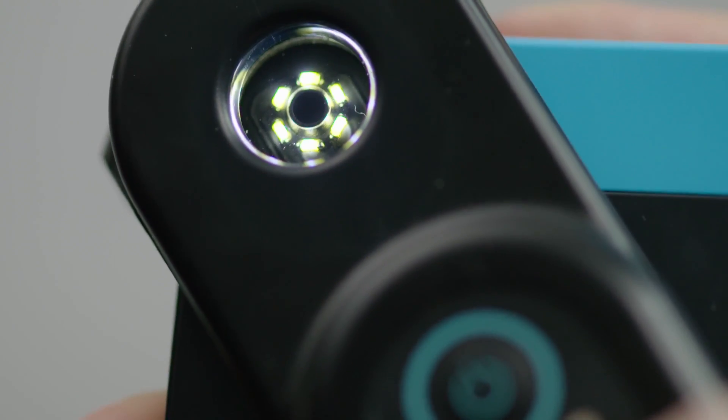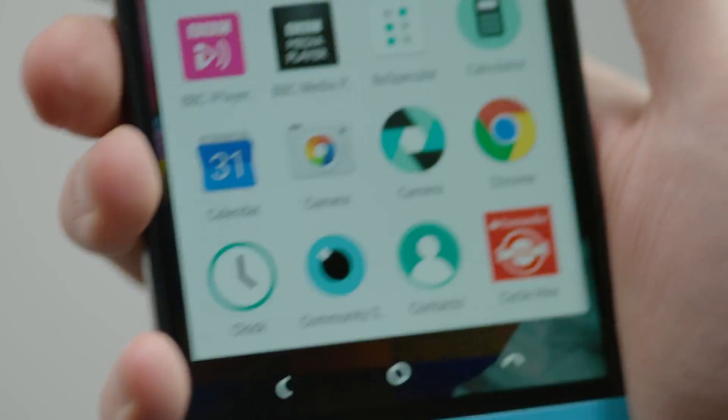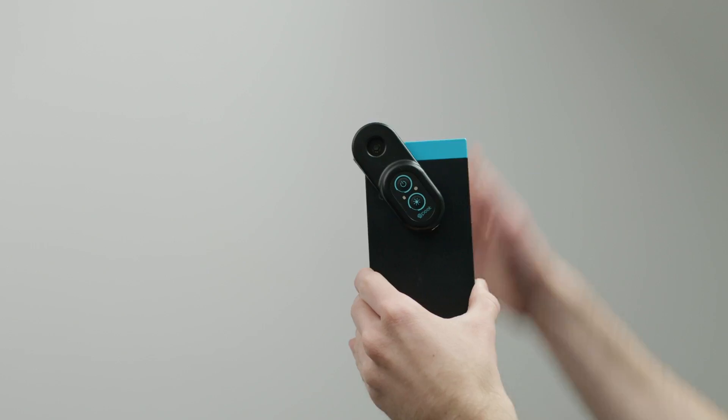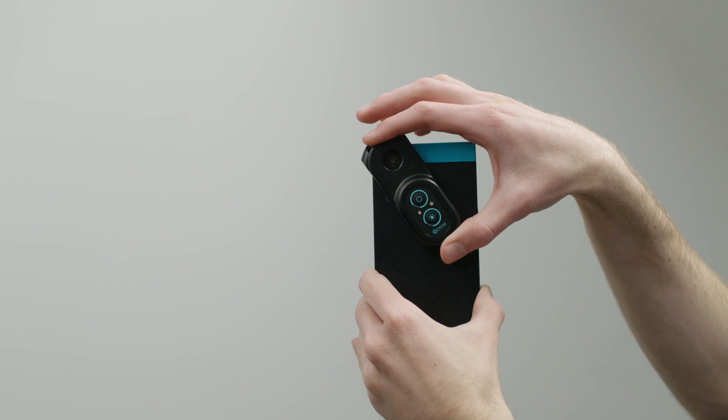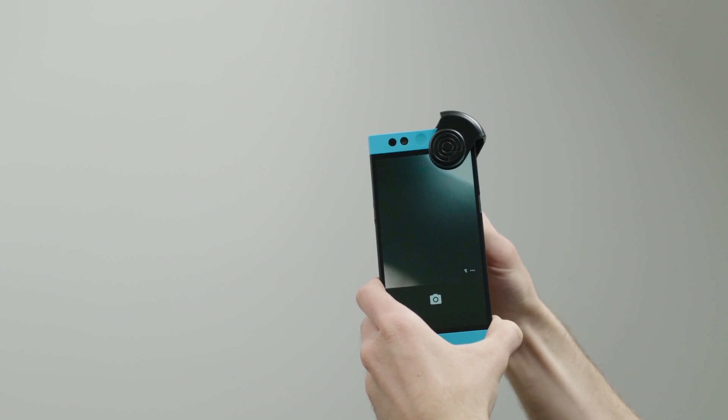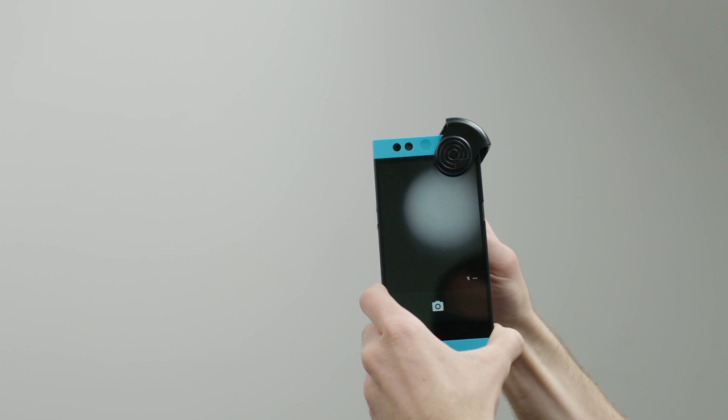Press the button to turn on the examination lights. Turn on your phone's camera application. You can slide Peak Retina up and down the clip until the image is in the centre of your phone's screen.